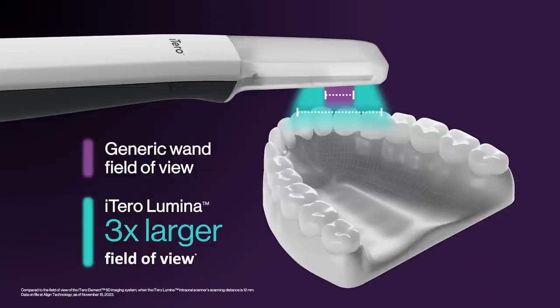Let's talk numbers and what those numbers mean for you. The field of capture for Lumina is three times larger than previous scanners, allowing you to capture wider segments of the arch in a single movement. The scanning becomes smoother, significantly faster, easier to complete and assures greater accuracy.